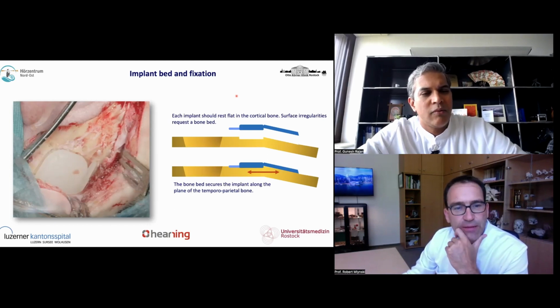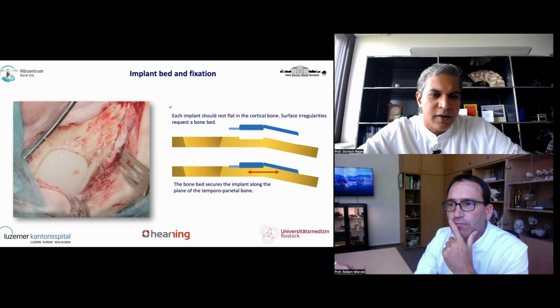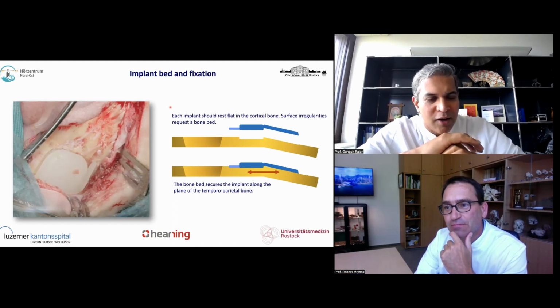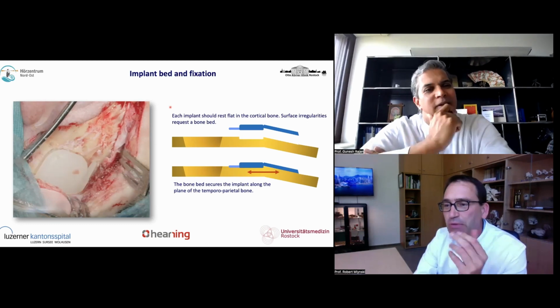So next step would be anatomy and mastoidectomy. Exactly. Interesting. You said you drilled the well before the mastoid. I did the opposite: I drill the mastoid first and then do the well. But I see your point. With regard to the workflow, I think it's a good idea to do the well first and then the mastoid, because after you've done all the drilling, you can just switch to the implant and don't have to worry about drilling or anything. Yeah, that's a good point. Everything is prepared.